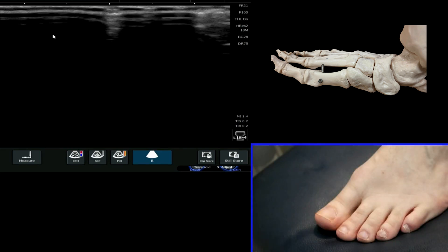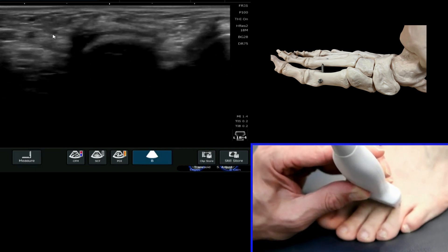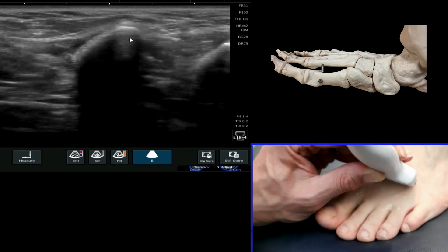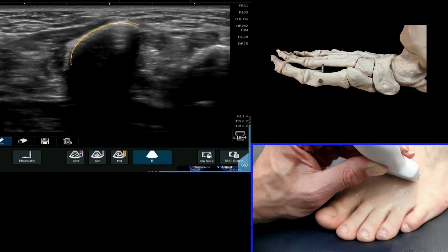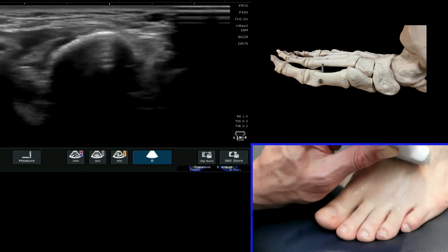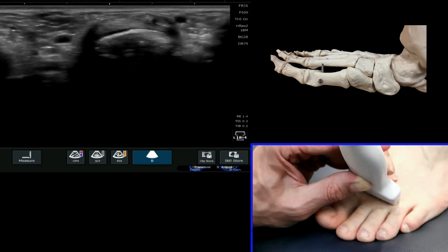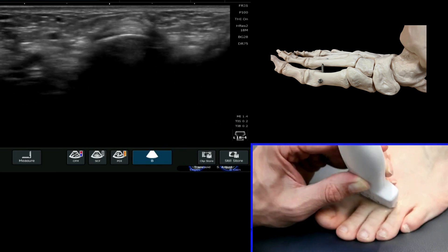When we're going to have a look on ultrasound, we're going to place our probe on first of all and find a metatarsal shaft. For the purpose of this we're going to find the second metatarsal, which is here. I would encourage you to get used to the normal appearance of these metatarsal shafts. You can see the outline of them very clearly. What you're looking to do as you evaluate is move your probe up and down these metatarsal shafts as far as you can, keeping them nicely centered in the middle of the screen, all the way down to your metatarsophalangeal joint, which is there. You can see that little drop away and you've got the extensor tendon on top.